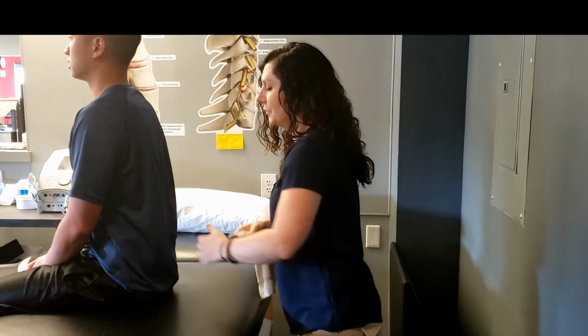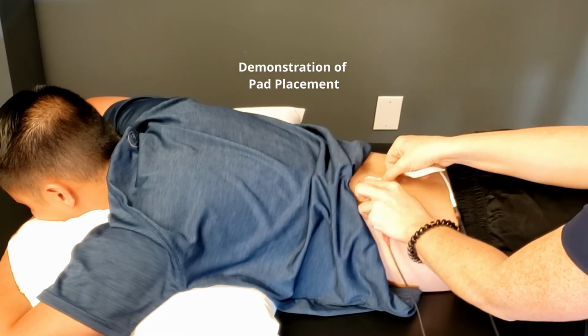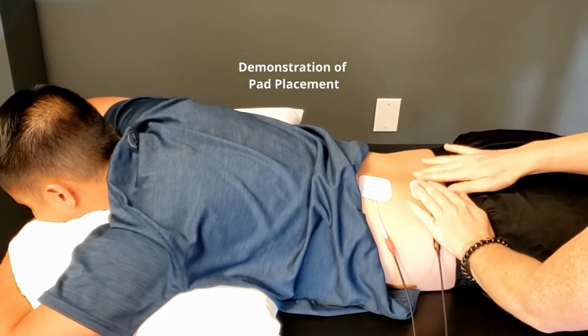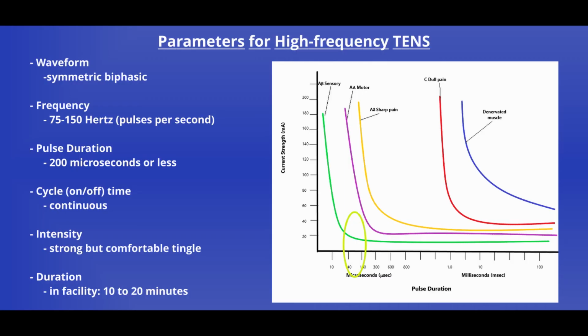Great. For both protocols, it's imperative that the electrodes are firmly attached to the patient and that there's no chance for the pad to become dislodged while the current is running. If you choose to use interferential or pre-modulated waveforms, the parameters are predetermined. If you use symmetric biphasic, here are some guidelines.